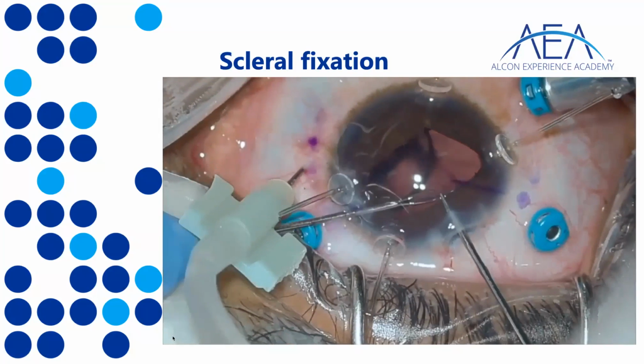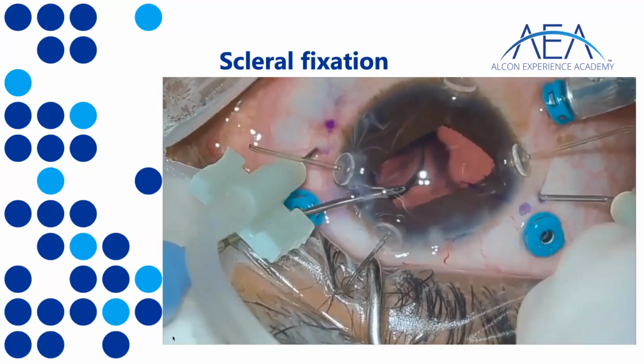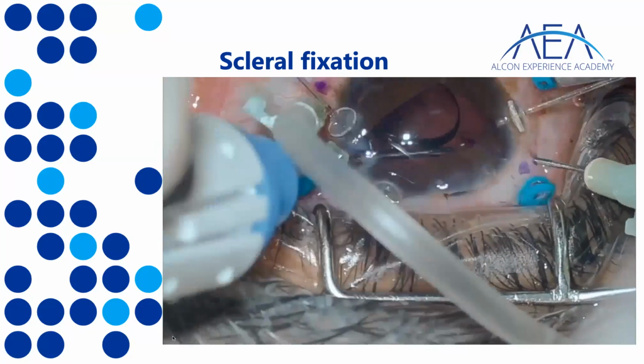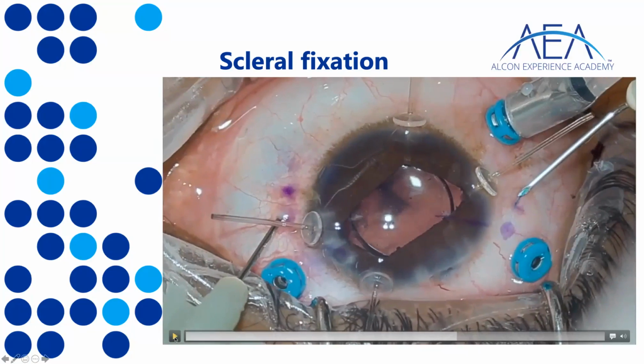This looks easy, I promise you, it's not. It's very fiddly. Again, you use a pair of forceps to slide it inside. You come out, and as you can see here, the lens is perfectly in place with one haptic still inside the needle and one just coming out on this other side.